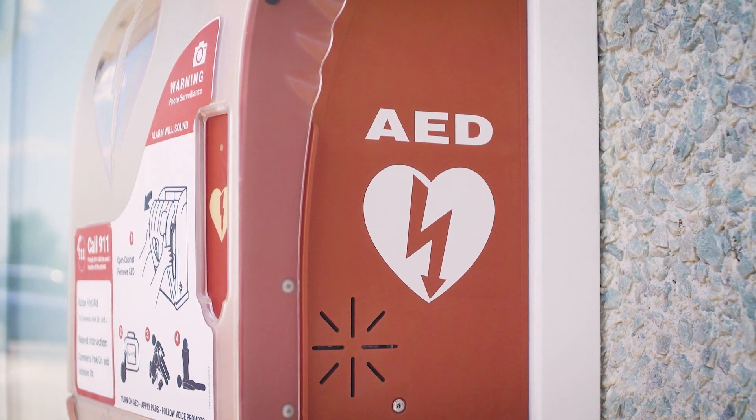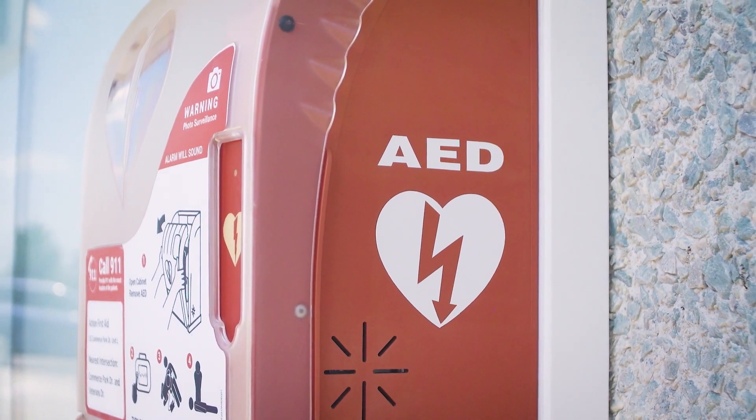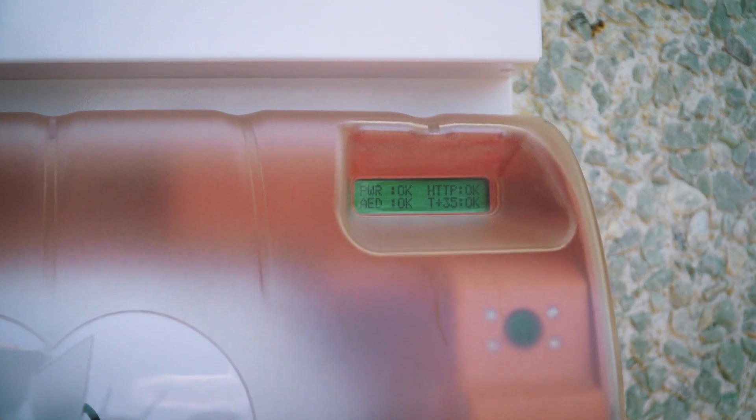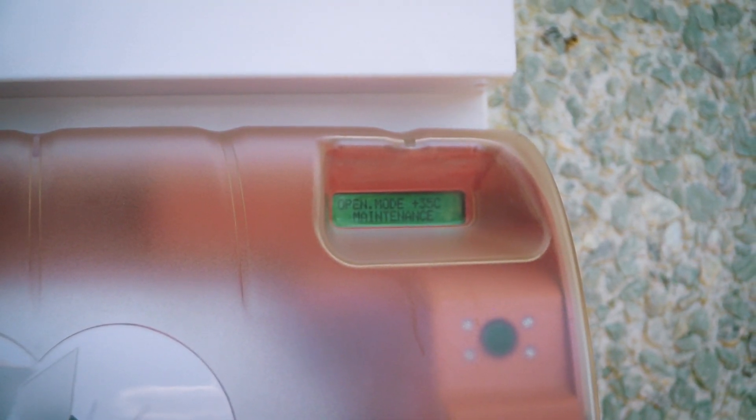To use the maintenance card, simply tap the card over the A in AED on the right hand side of the cabinet. You will hear the cabinet beep and the LCD screen will show maintenance.